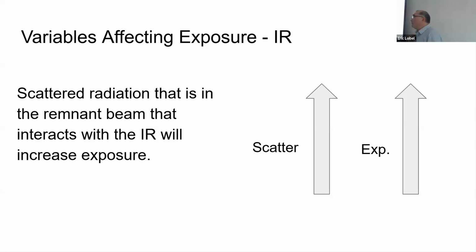We're starting. It's the same way flat panel detectors started. You had one with a cord on it, so you really couldn't go anywhere, right? Rooms had two flat panel detectors, one built into the bucky that was upright and one built into the table. A lot of money at $80,000 or so a piece. Things got better. They put a big cord, like an old-style phone cord, a pretty good solution, right? And now you can take it from the table to the upright. And only fairly recently have they come up with portable flat panel detectors.